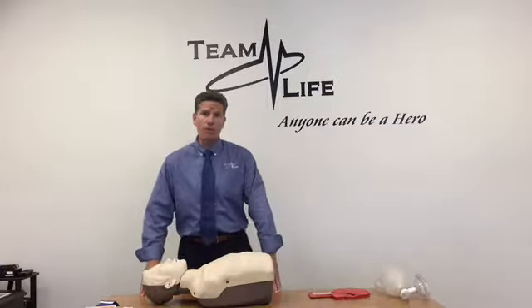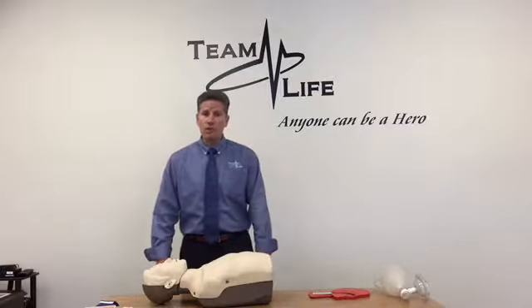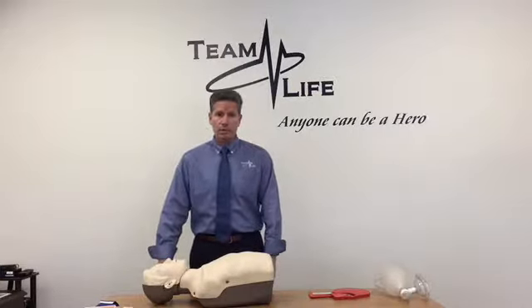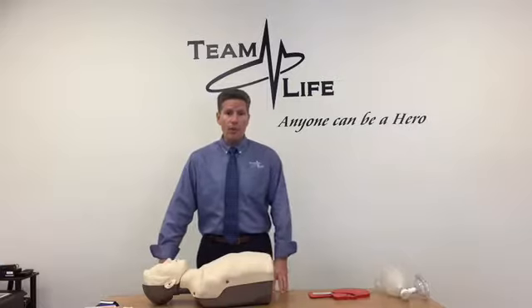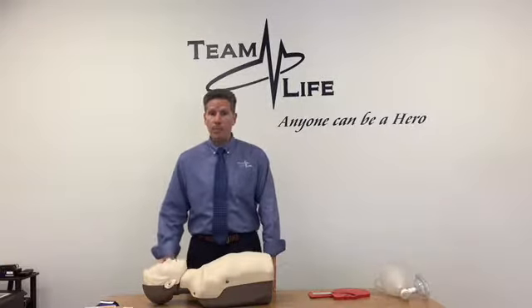In this lesson, we're going to review the administration of Narcan. First thing we want to do is recognize an opiate overdose. During an overdose, opiates overwhelm certain receptors in the brain, interrupting a key part of the body's impulse to breathe. Breathing slows dangerously or stops. Reversing this process quickly is crucial because without breathing and oxygen, brain damage or death can occur.